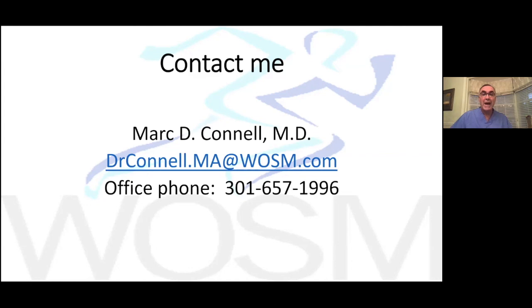Ralph asks, do you use ROSA for knee surgeries that don't involve knee replacement? The answer is no. This is specifically for arthroplasty technology. So, for example, for anterior cruciate ligament reconstructions, or for any other knee surgery, reconstructive or reparative, the ROSA would not be involved. It's specifically for knee arthroplasty operations.